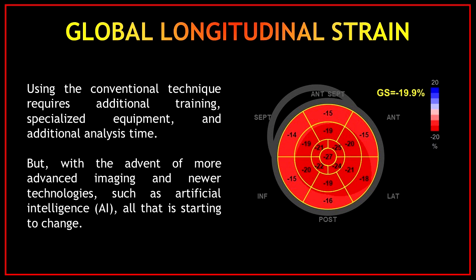And why is GLS technically challenging? Because using this conventional technique requires additional training, specialized equipment, and additional analysis time. However, with the advent of more advanced imaging and newer technologies such as artificial intelligence, all that is starting to change.